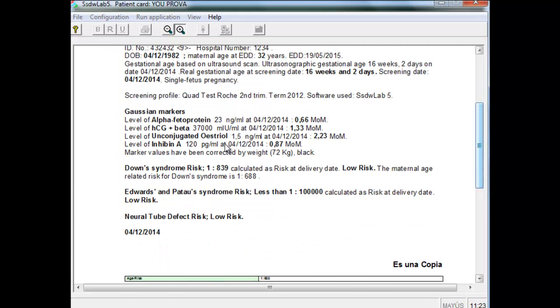We can observe all the data about Down syndrome, Edwards and Patau, and graphics related to each risk.